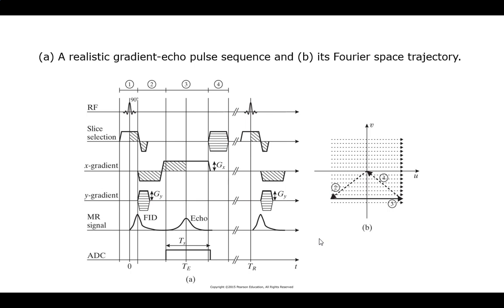It's exactly what you're doing, right? Remember, it's going to naturally decay on its own. They don't really move perfectly straight in lines here. There is some natural decay. We try to read it out in a quick enough time period that you're not going to really worry about those types of effects. But if I ramp everybody up, it's going to naturally cause them to decay, particularly that slice, a little bit faster. And so I just kind of accelerate them.